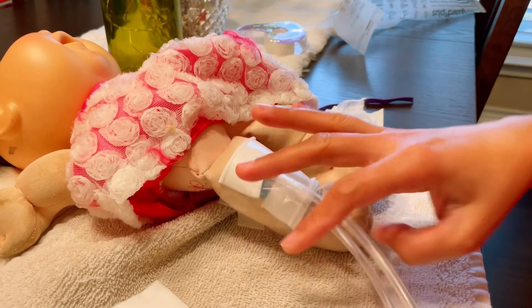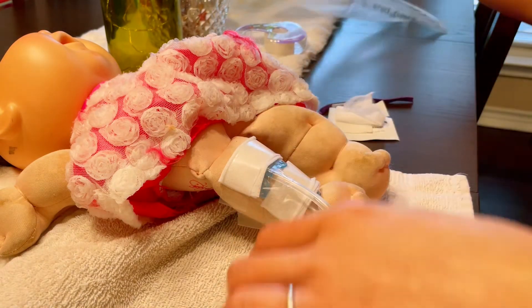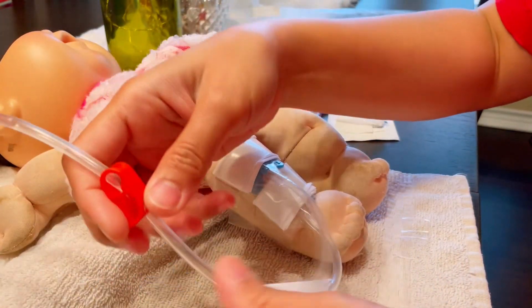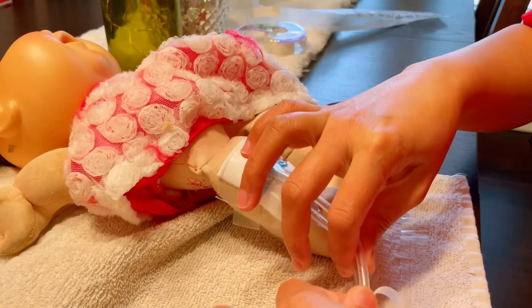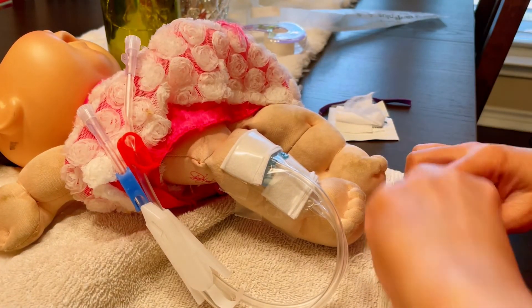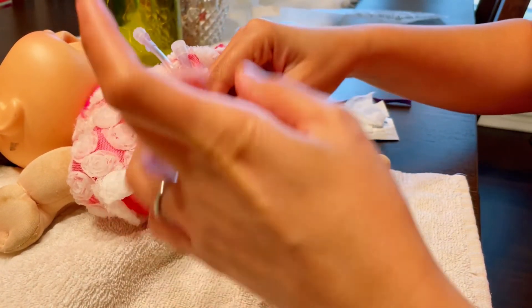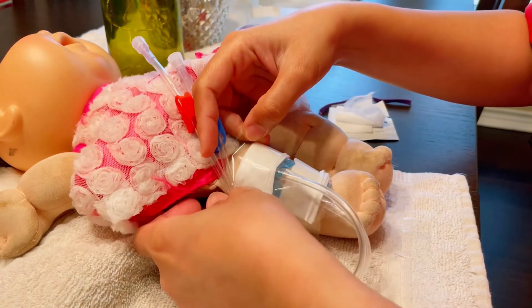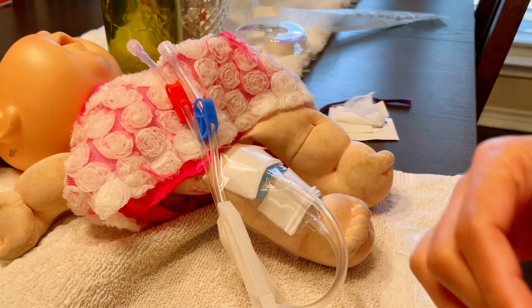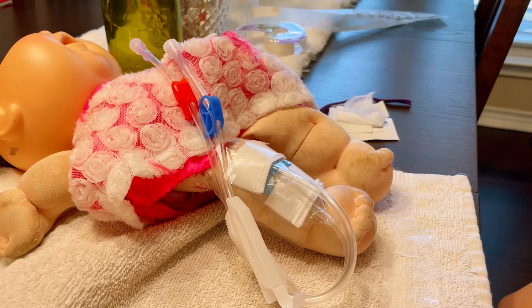Let's say your patient keeps moving around. If you think the patient can't sit still and keeps shifting their access, you need to tape the tubing to their body — to their shoulder or their shirt — but not to the chair or the table. Taping to the chair is not allowed. Secure it to the patient's body so the access doesn't get dislodged.